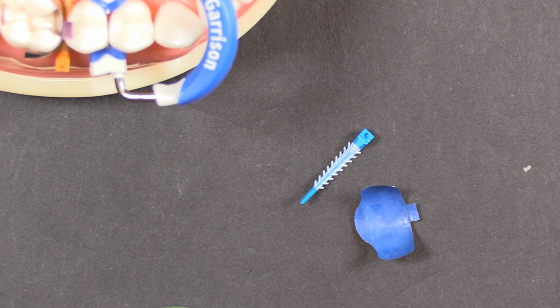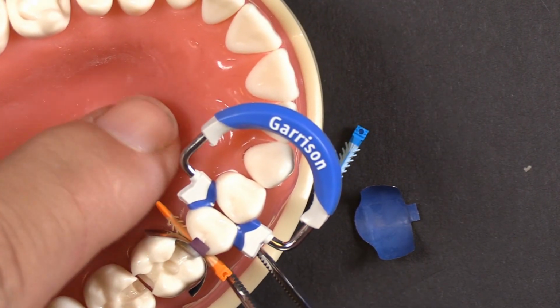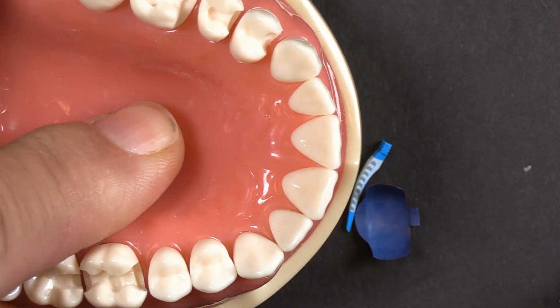So I had a question about Dr. Jose Luis Ruiz, a lecturer who lectures on Garrison products quite frequently. One of the things he's talking about now is doing some of these restorations without breaking the contact for the placement of the matrix band, and there's a couple of ways to do that. The question from our write-in person was, his technique recommends the use of a fender wedge to create some separation while you're prepping the tooth so that you can get the matrix band in.